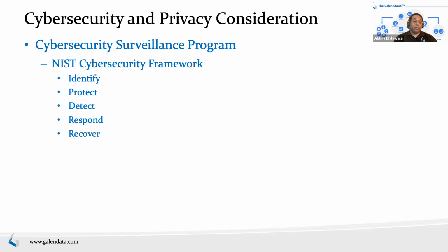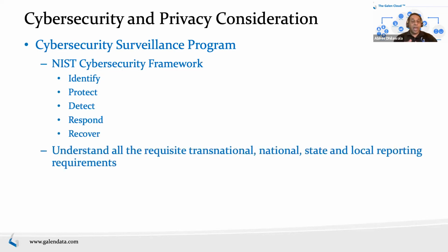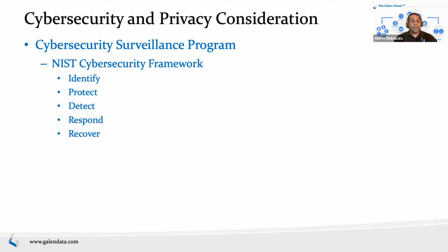And the last thing is you want to recover, right? So you responded, you did something, how do you recover? Again, you do some of this work upfront and make sure that there are ways to recover, right? So are you keeping a backup of your data? Do you have a hot site? Do you have device functions that can be disabled in case, but the major functions are still available? So things like that, how do you recover so that the system as a whole is still working, even if it's reduced function for a while, so that the vast majority of users are not affected. So those are important things.